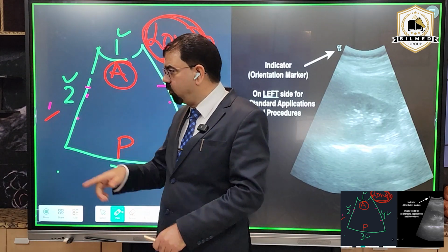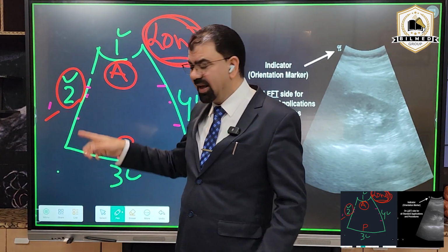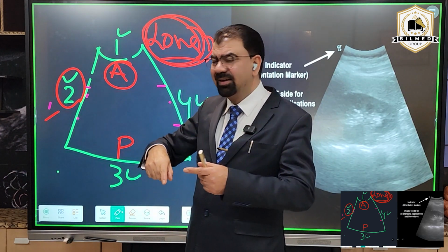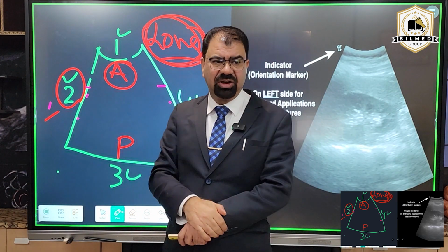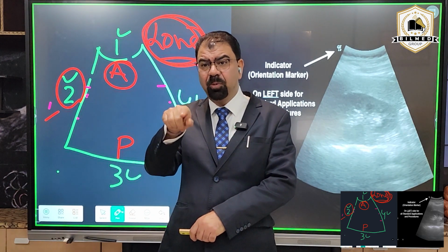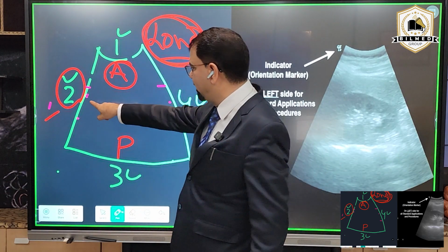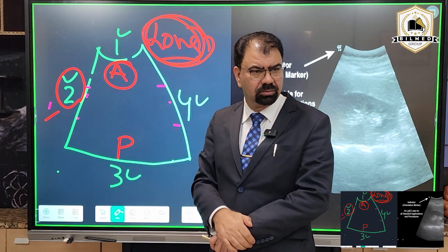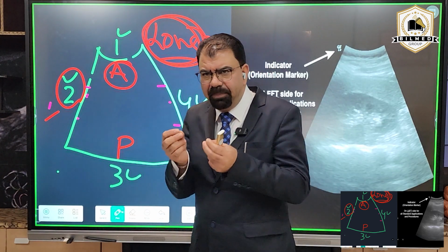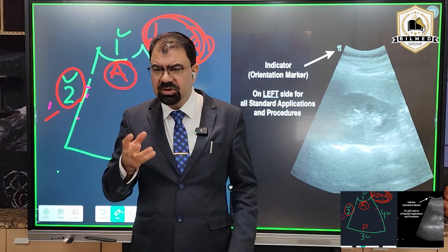Now, what is there this side at 2? What was previously here right? What is that right replaced by when I am now in longitudinal section, and I have rotated the probe clockwise? Hurry up. Others post in comment box. What will be at 2? This is a very basic ultrasound. These things are very important.